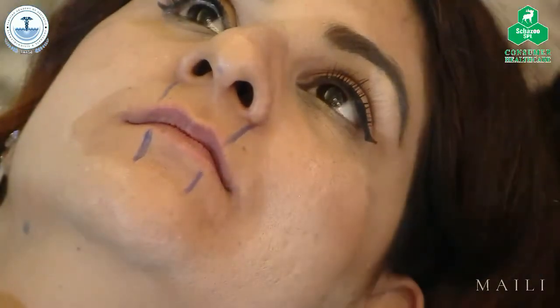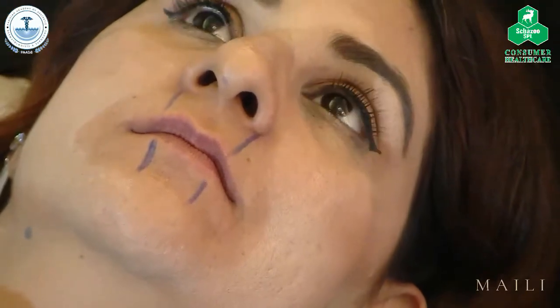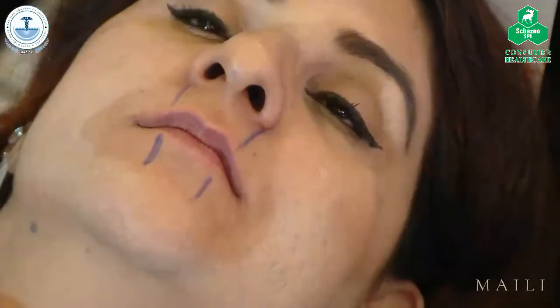Can I have a needle, please? Rami, do you always mark the lips? Not really. Now I know that I'm just going to stick to the middle, so I don't mark them. But for teaching purposes, yeah, that's good. This is the area that I'm going to stick to.